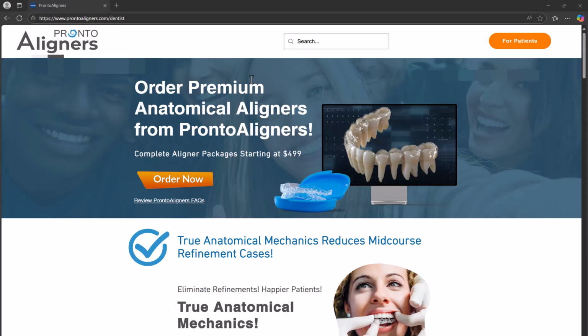Ordering your aligners through LabPronto is the fastest, most efficient, and cheapest way to have your aligners manufactured. In addition, your patient will be activated in BlueSky Monitoring. You will receive the monitoring scope with the aligners for the patient, and the patient, together with the scope in the clinical backend, is completely free of charge. It is an add-on bonus when ordering aligners through Pronto Aligners.